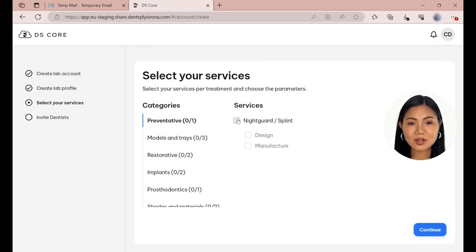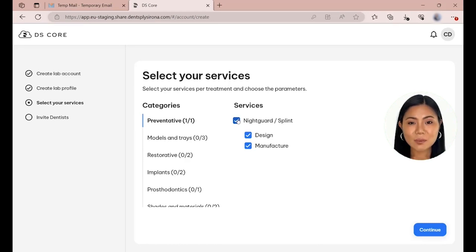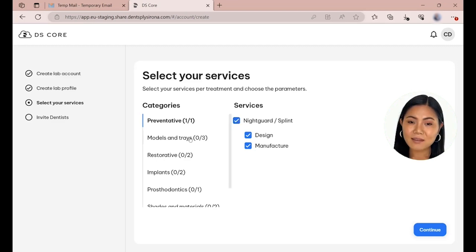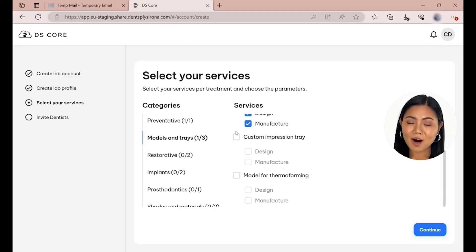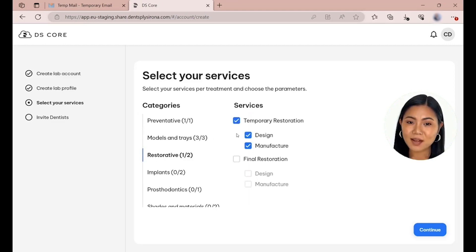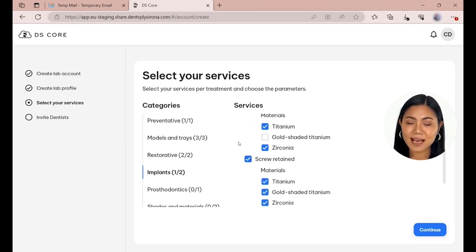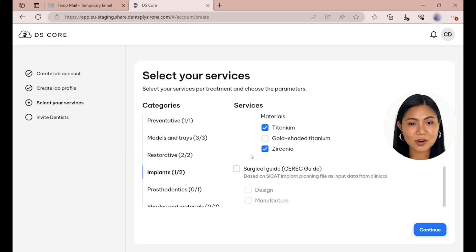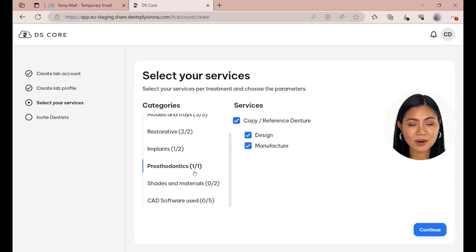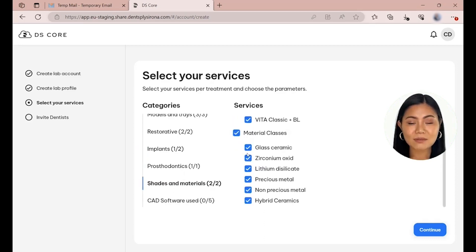Select your services per treatment and choose the parameters. For example, we select under Preventive the service Nightguard/Splint and then indicate that we offer design as well as manufacturing for this indication. Repeat that for all treatments, shades and materials, and CAD software used. The information provided is used to ensure that a laboratory only receives orders that match the range of services it offers.